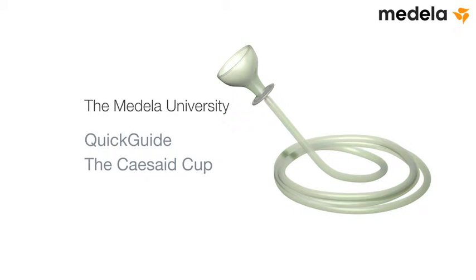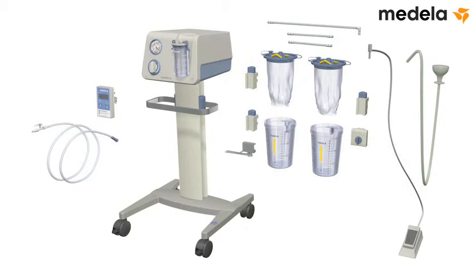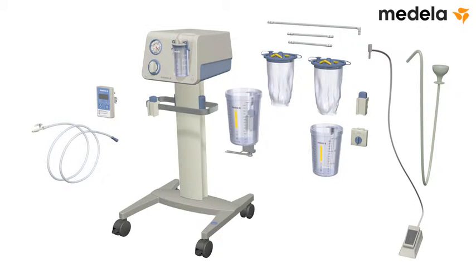The Medela University Quick Guide: The Cezade Cup. Attach the clamp holder on the rail. Attach a 1.5 litre suction jar for the disposable system.